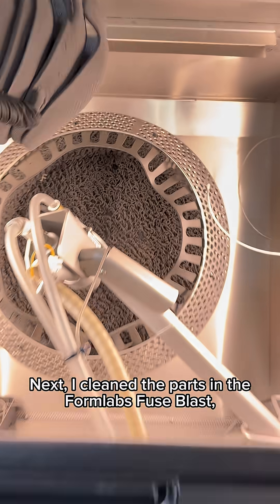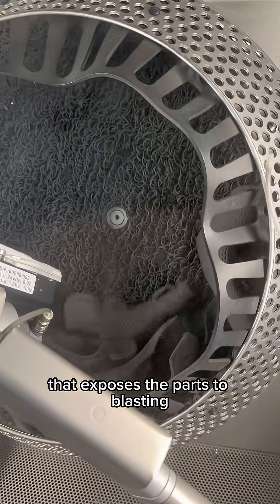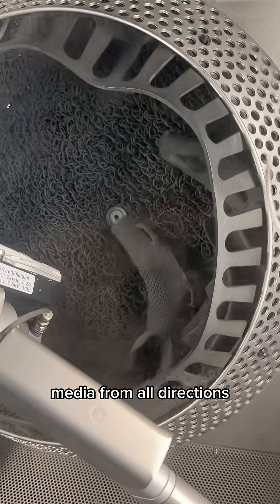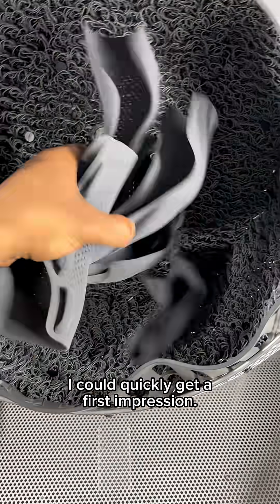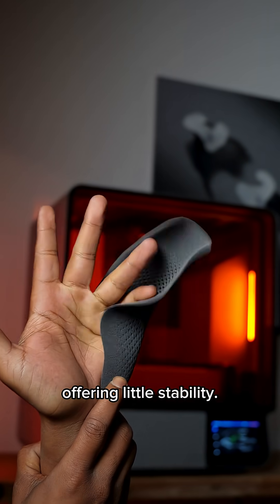Next, I cleaned the parts in the Formlabs Fuse Blast, a fully automated cleaning and polishing solution that exposes the parts to blasting media from all directions. With the parts fully depowdered, I could quickly get a first impression. The 2 mm wall thickness was far too soft, offering little stability.